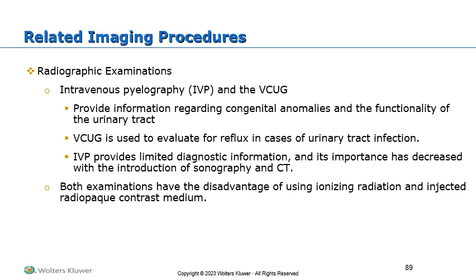So both of these are really great exams. They're not that expensive, but they may require very young patients to be sedated, so that would increase their risk. It also would require radiation, and so those would be cons. In fact, so much so that the IVP especially is of very limited use in pediatrics and actually in the general population anymore. The other thing with both, especially the IVP, is that we have to inject contrast, which can have some pretty significant contrast reactions, and so that would be a secondary issue with that particular exam.